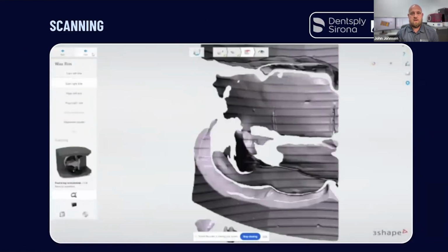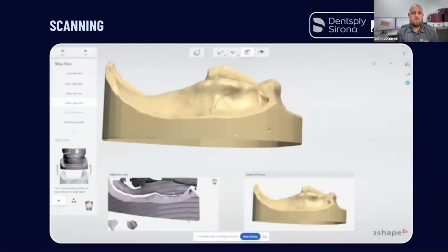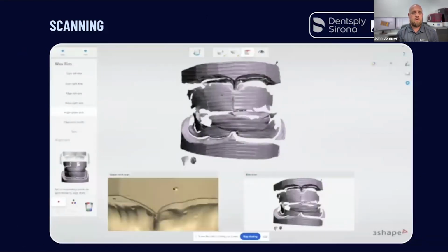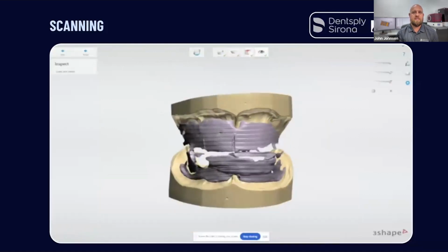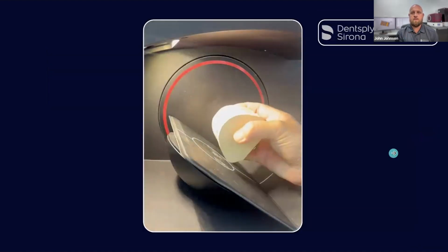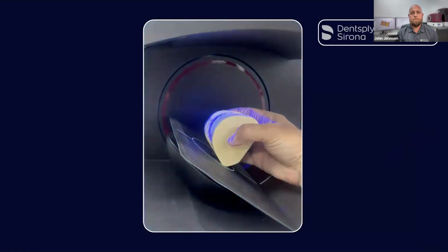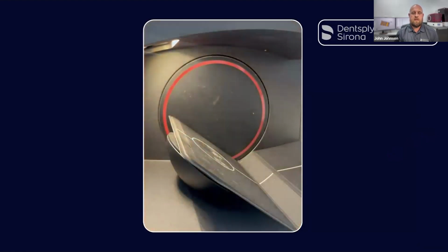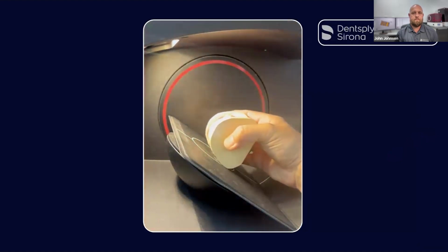And then this is my virtual articulation. Now in my lab, we score the underside of models. I use a hot glue gun, toothpicks, whatever the case would be to get this case mounted on an articulator. And this is what I do now. Hold the thing very still. I scan the right bite, and it's prompting me to do all these things. And then I'll scan the left bite.